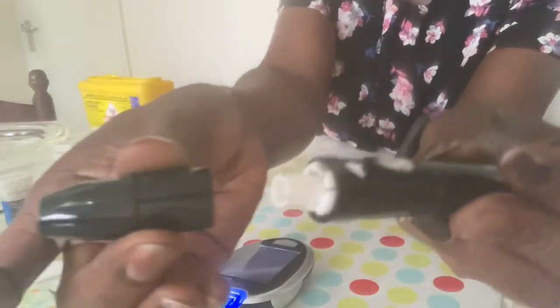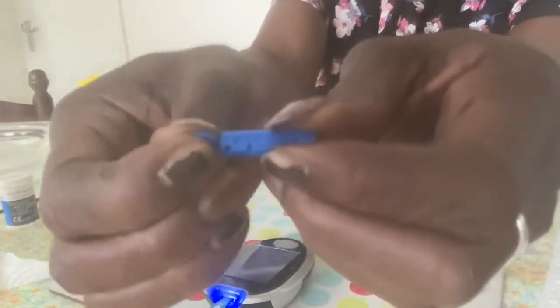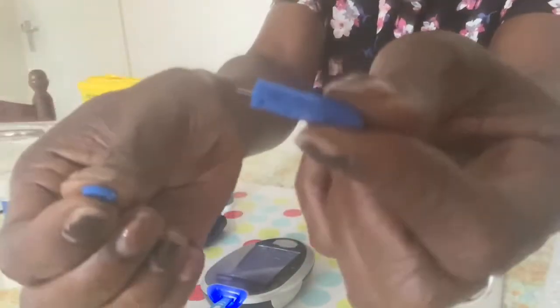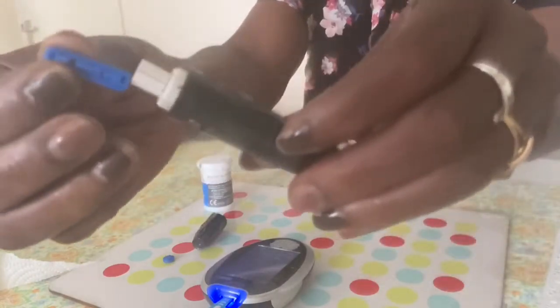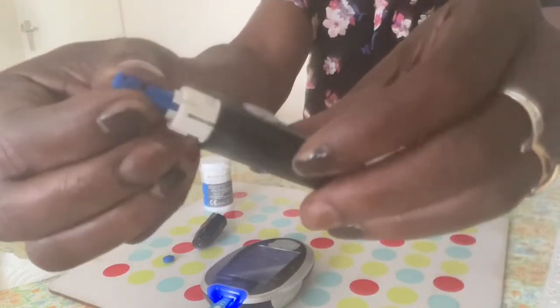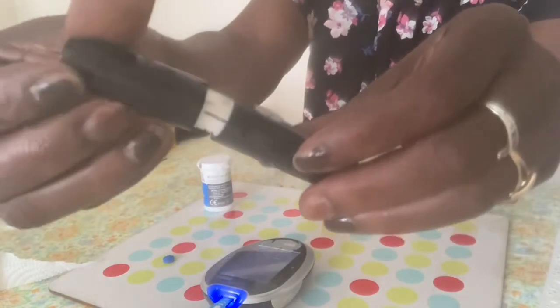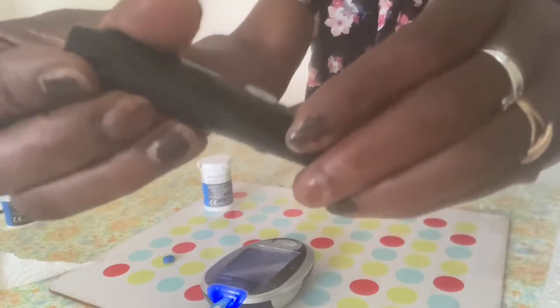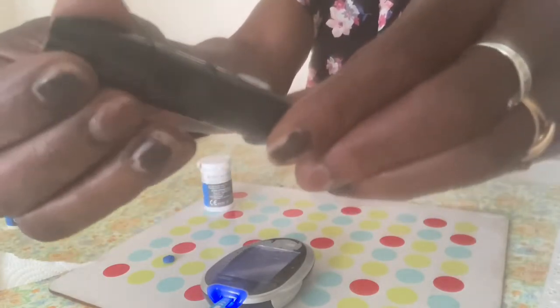Remove the cap from your finger pricking device and put in a new lancet. Then put the cap back on and set the device by pulling or clicking the plunger.